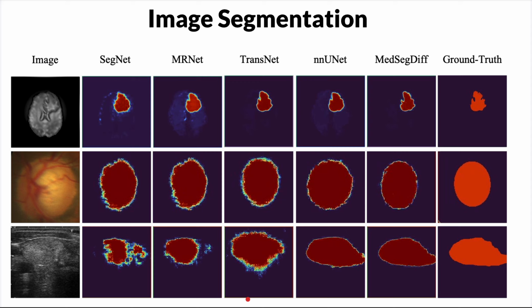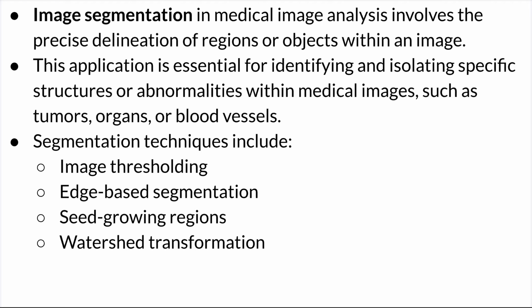It normally uses the intensity of the pixel. So a group of pixels with the same value will be segmented together, whilst those with different values will be segmented differently.